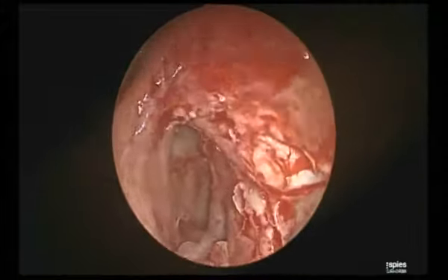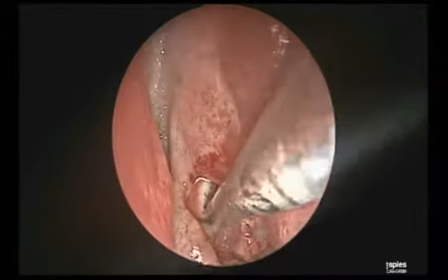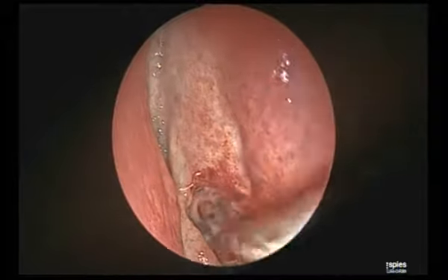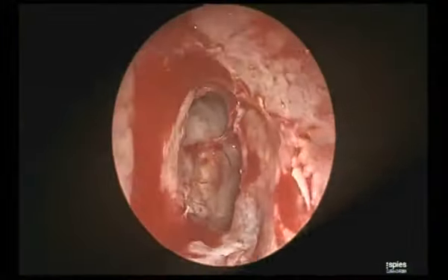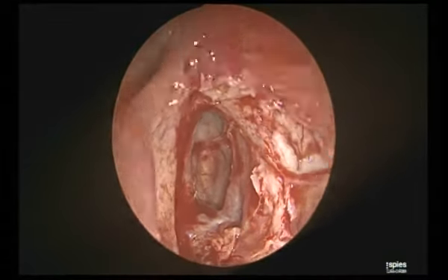It cannot work. It should be mucosal lined. Yes, that's the key. The only important thing is you need to exenterate all cells in this region. Number one, it should be completely mucosalized. If you strip out the mucosa, the fibrosis and scarring that ensues later on is the big trouble. That is inevitable. Point well noted. And number three is, if you leave the septa, that can be bridged by the scarring.